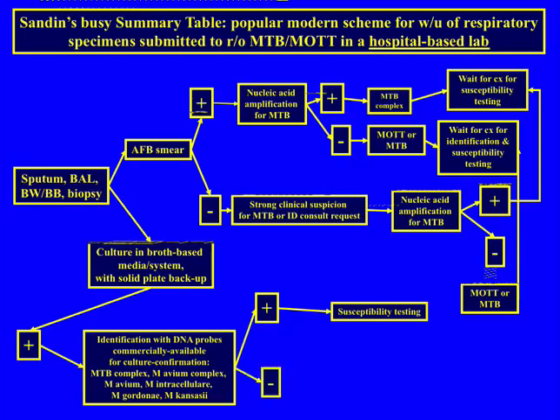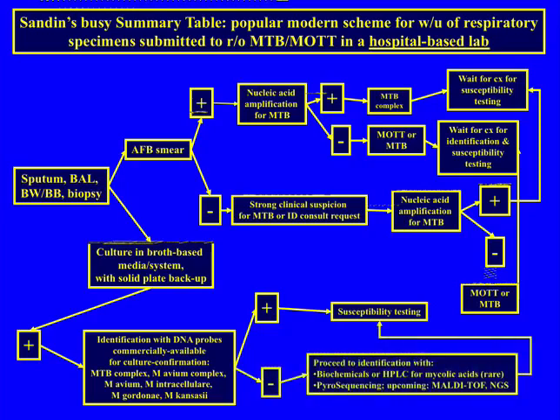If it is negative for that, then the labs have to proceed with, years ago, biochemicals. You don't do that in this country. They take too long and you get sued. We then move to HPLC, high pressure liquid chromatography. That's not done hardly for mycolic acids. What we're doing now is put it through pyrosequencing or next generation sequencing. That's what the reference labs are doing.